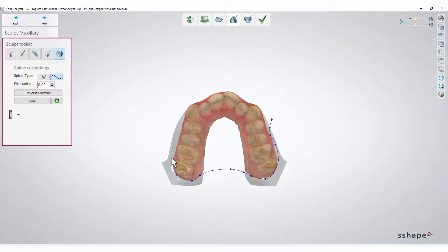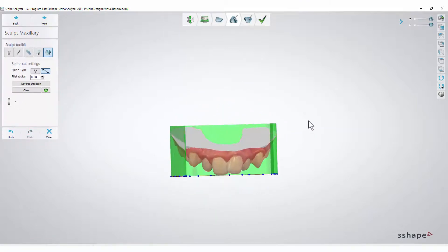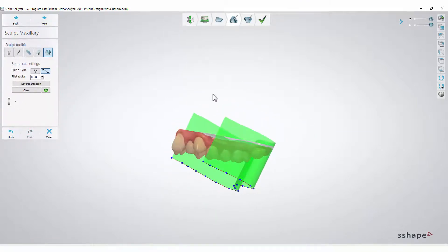The last point should also be outside the base. Click the green Apply button. As you can see, now you have a nicely shaped arch to export and print out. Press Next.